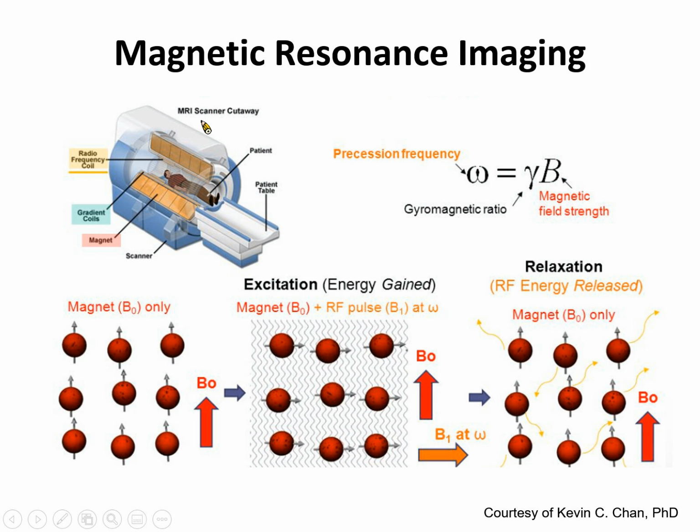But why do we need this magnet? That is a very important question. Because with this magnet, we can turn every particle in our body to a single direction. Every atom, every particle has its own direction of spin.